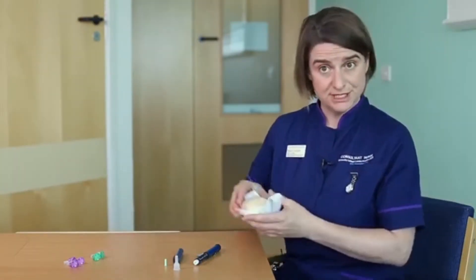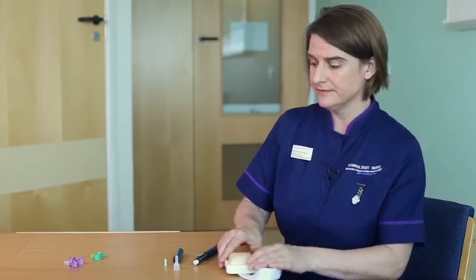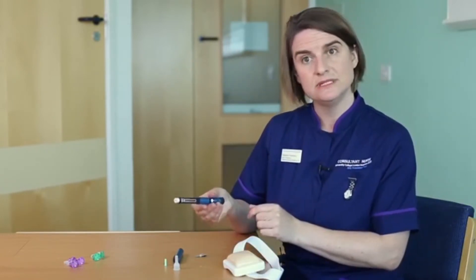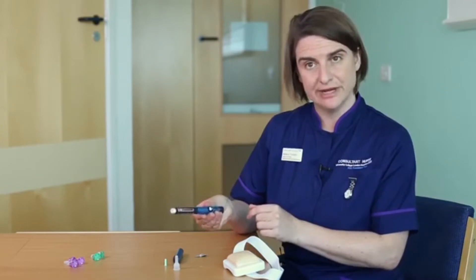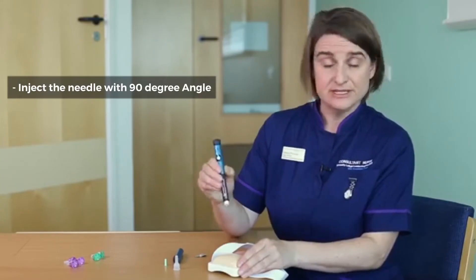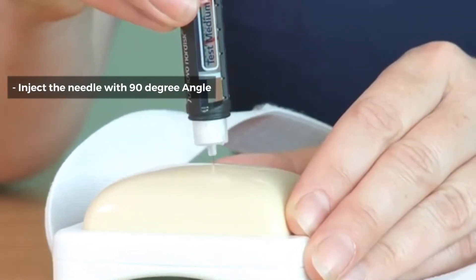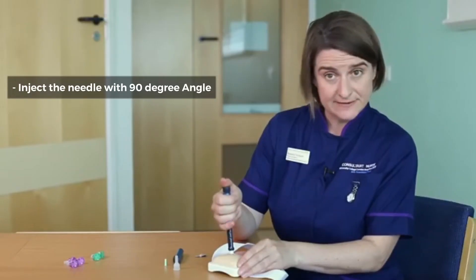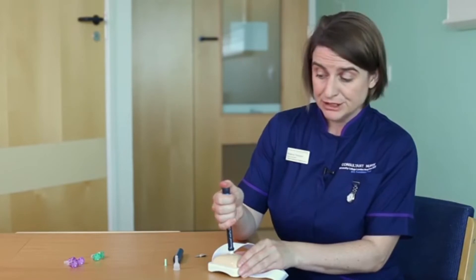So I'm going to use this injection device to demonstrate. Picking up your pen, you need to remember to dial the number of units that you're going to give. You're going to go in at a 90 degree angle, and then once you've injected into the skin, move your thumb to the end of the pen and push down.